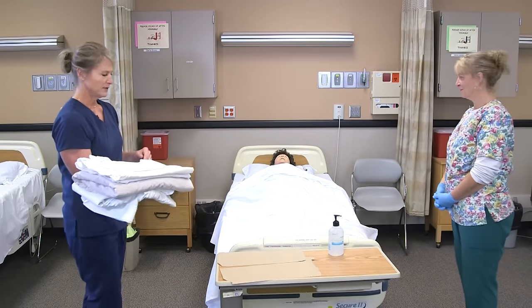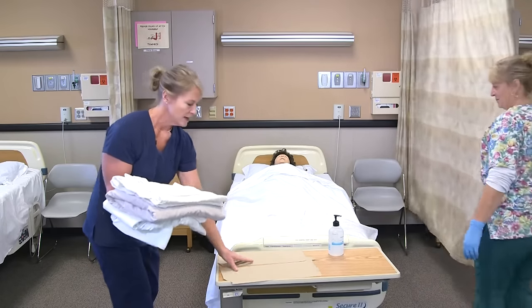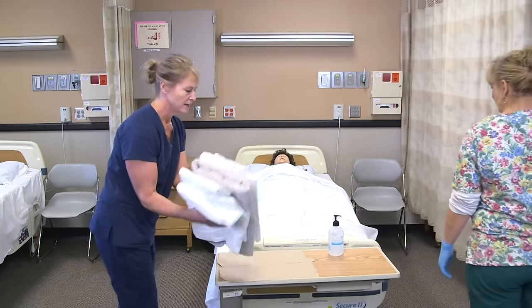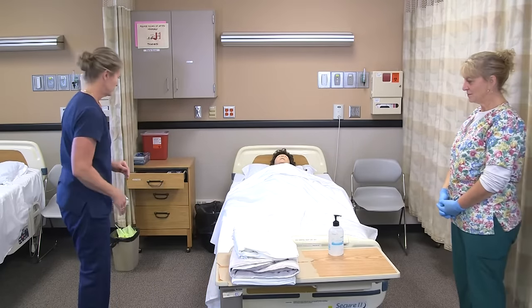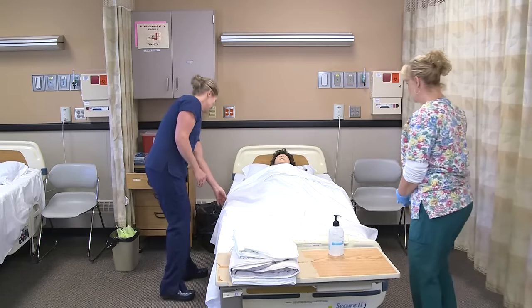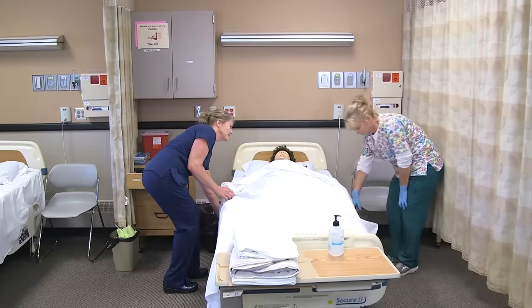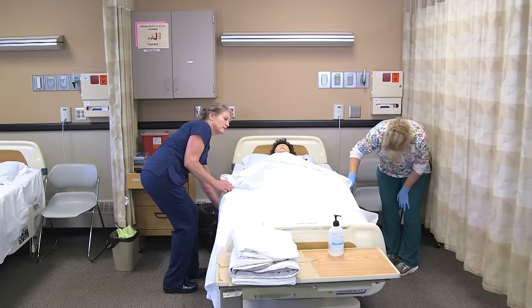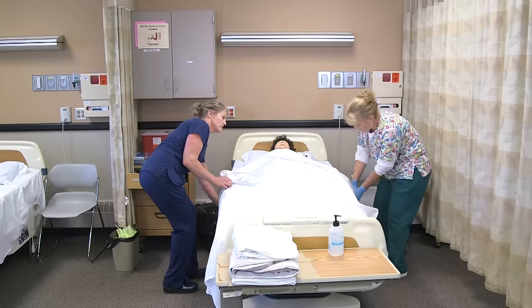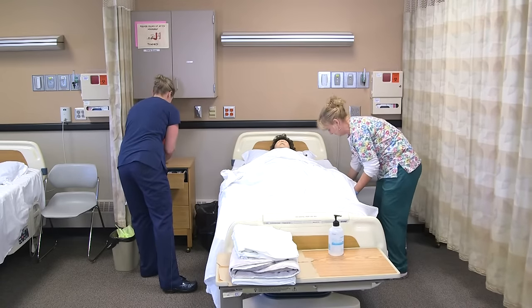We pull the curtain for privacy and then I would put the linens down on a clean surface and flip them over, since I got them in the order they go on the bed. Annie, we're going to raise the bed up so we can help you a little easier. I'm going to put on my gloves because we're removing dirty linens first.